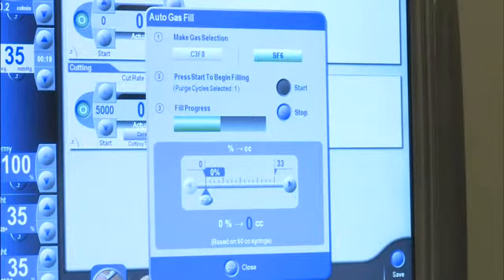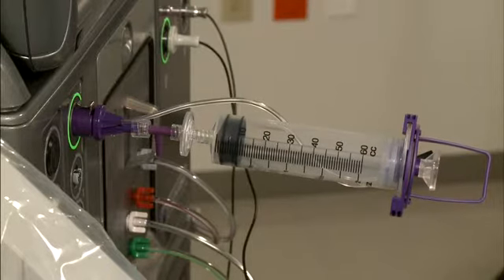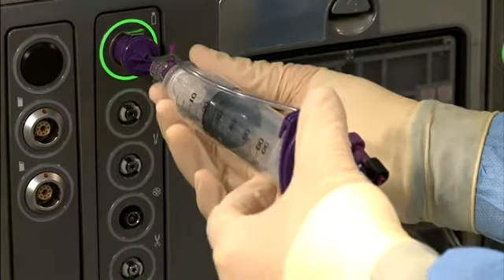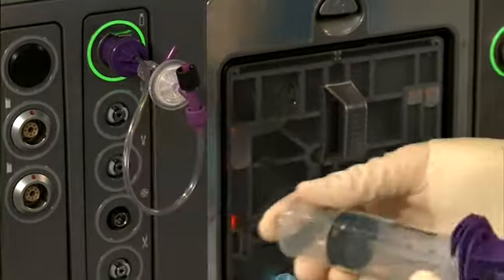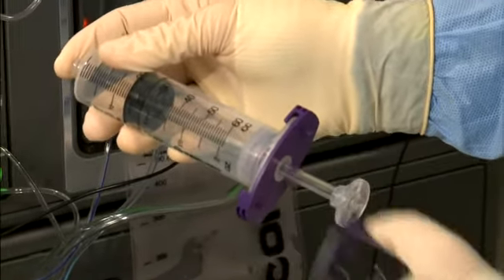Once the fill progress bar is completely green, the gas fill is complete. The machine dispenses 20 cc's of undiluted gas. Remove the auto gas fill syringe assembly by disconnecting the syringe from the filter. Disconnect the clear tubing and attach it to the end of the assembly on the machine. Disconnect the plunger stop from the syringe assembly by twisting counterclockwise.